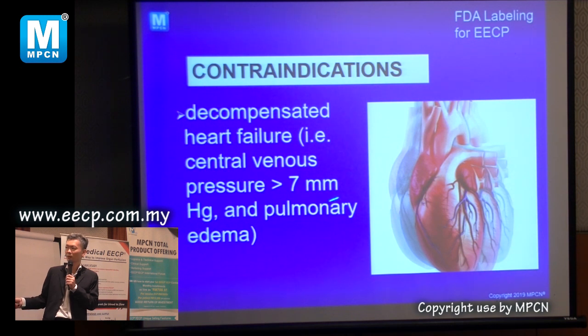It's called pulmonary edema. So if you're a doctor, there are a few ways to check. You listen to the lungs, a lot of noise, crackles. And then you can see this vein is very high up. So if you have this machine, when they squeeze, there's a lot of blood flowing back. We call it venous return, and then it goes into your lungs and adds more water. So you are already flooding, and you add more water. That can kill the patient.